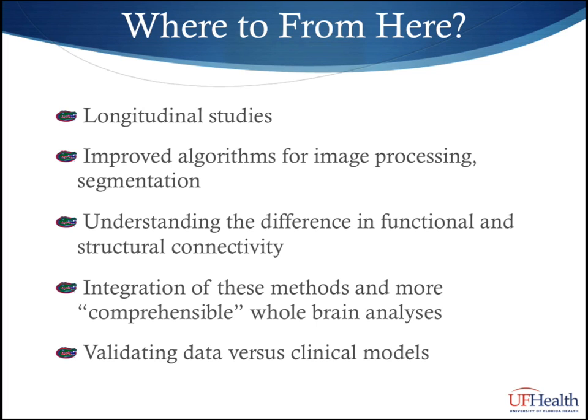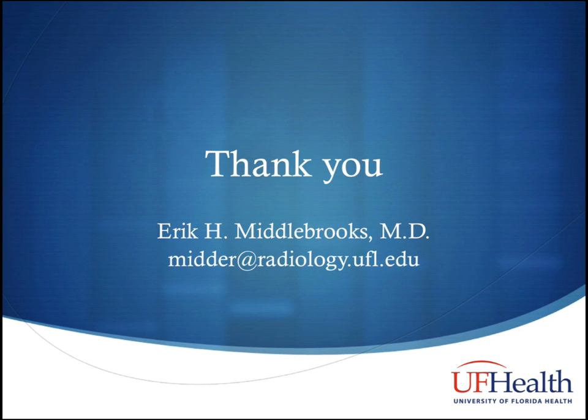And going along with that, what we really also need is integration of these methods with producing a more comprehensible whole brain analysis. And unfortunately, the brain is so complex in its workings that oftentimes these studies are really hard to interpret, particularly when they're abnormal, what is going on. We also need further validation of our data versus clinical models.